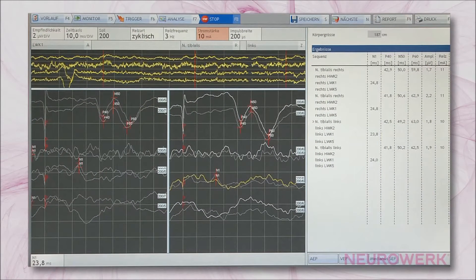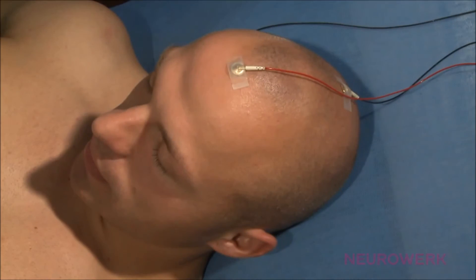The instrument settings for the SSEP of the tibial nerve should be selected as follows. Amplification: 2 µV per division. Timebase: 10 ms per division. Stimulus duration: 200 µs. The limiting frequencies at Neurowerk EMG have been stored in the setup settings and cannot be directly changed. Obviously, the device settings should be configured to suit the particular diagnostic requirements.